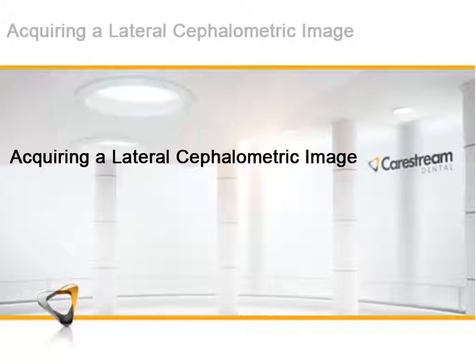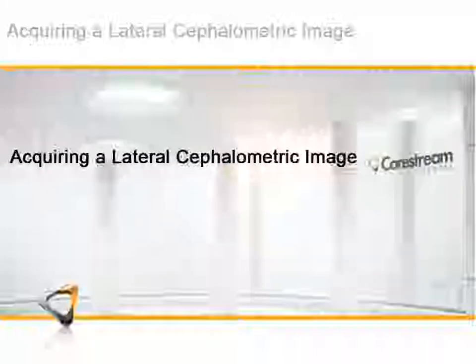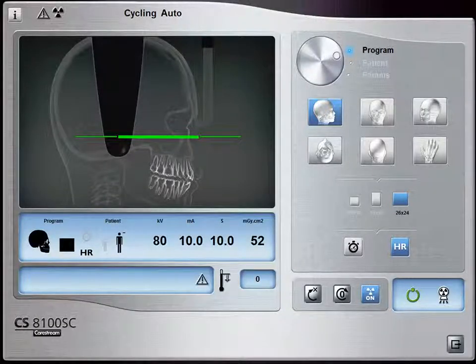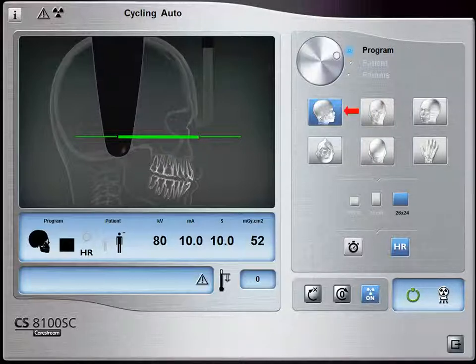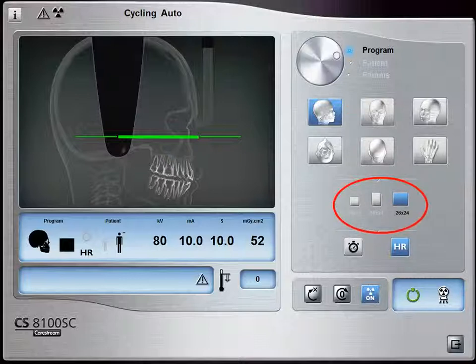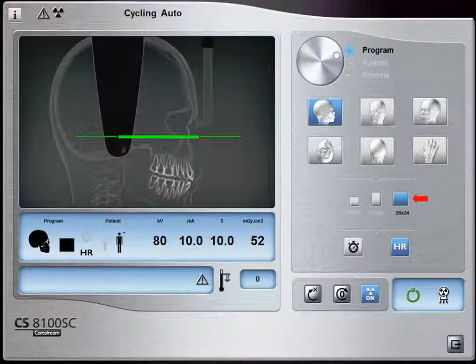Acquiring a Lateral Cephalometric Image: Position the head clamps manually for the type of exam you are performing. In the Cephalometric Acquisition window, click the Program button to access the Program pane. In the Program pane, select a button for a Lateral Exam. Select the appropriate Acquisition Format size — select Fast Scan for a quick exam or select HR for a higher resolution exam. Note: the 26x24 field of view does not come with a CS8100SC Access; it can be purchased separately.